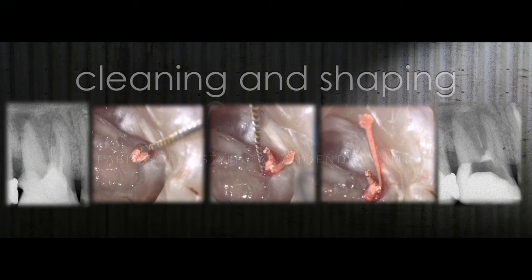First, we have to clean and shape exactly the area of the perforation. In this case, the previous treatment packed the perforation with a gutta percha cone. So they made a big mistake. They thought that the perforation was the canal orifice, so they used the gutta percha cone inside the periodontium. If we want to reach great success, we have to remove the material inside of the perforation.